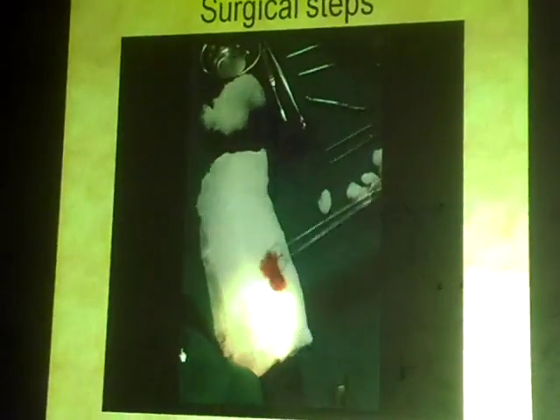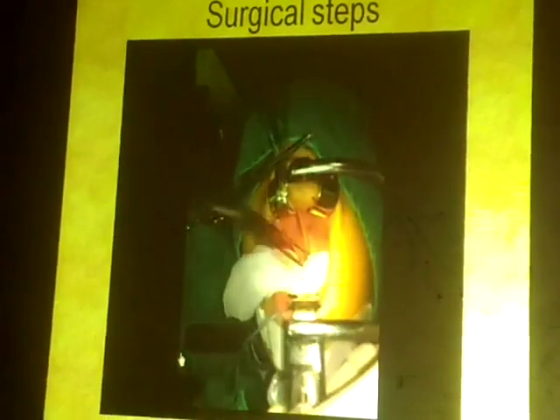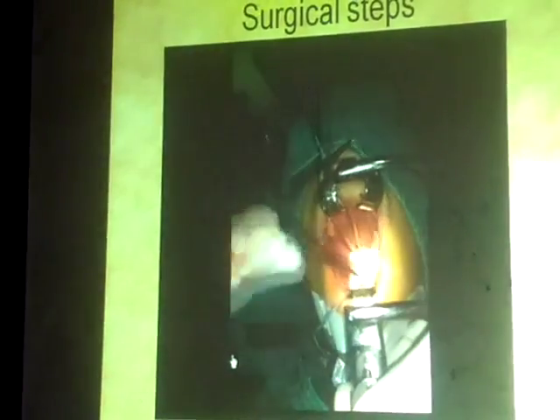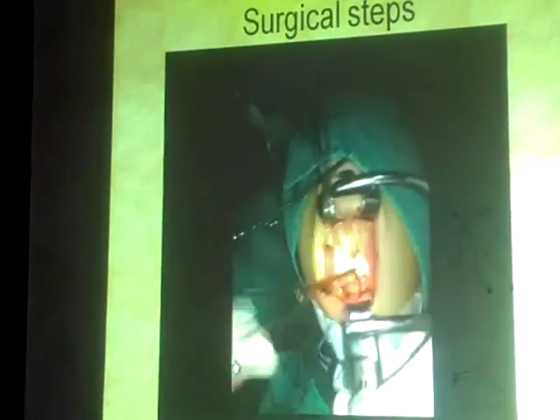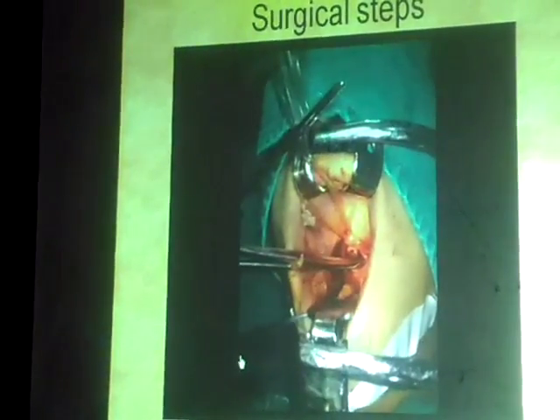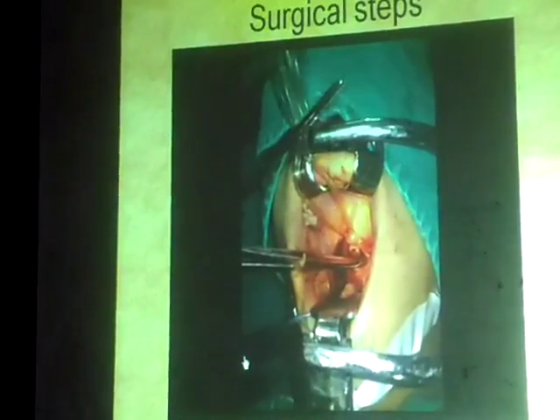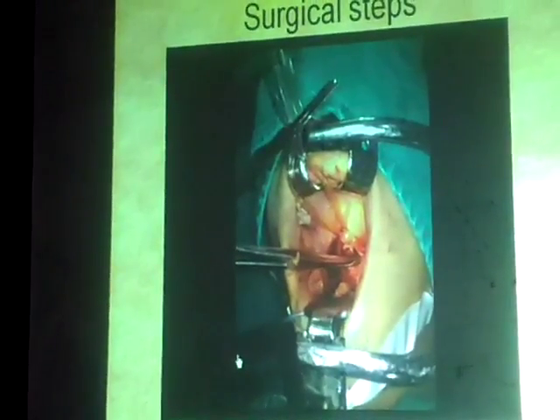So I'm curetting again because I've seen a remnant. And then I'm going to put a dry gauze back. I will leave it there for about 5 to 10 minutes. If I'm going to do tonsillectomy, I'm going to do tonsillectomy and then come back and see. If I'm going only to do adenoidectomy, I'm going to leave it for about 5 to 10 minutes.